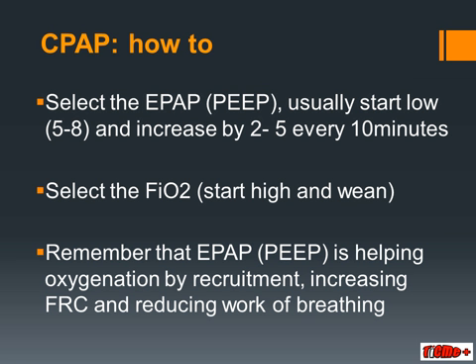Remember that the EPAP is helping by recruiting extra alveoli, by increasing the functional residual capacity, and by reducing work of breathing. In acute pulmonary edema, the EPAP also increases mean intrathoracic pressure, and this reduces venous return to the heart.